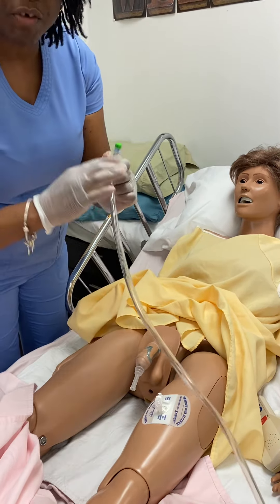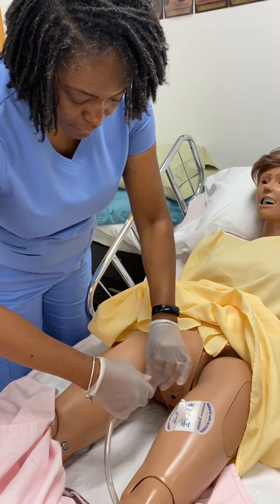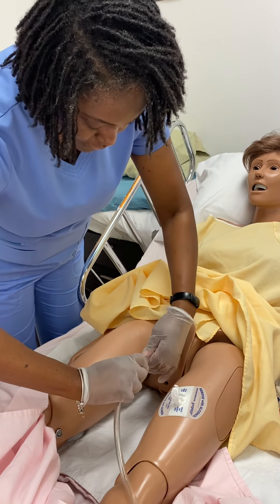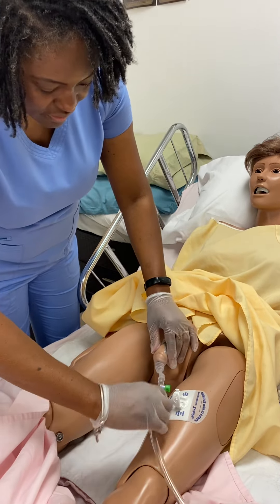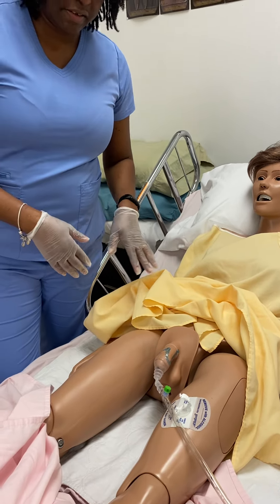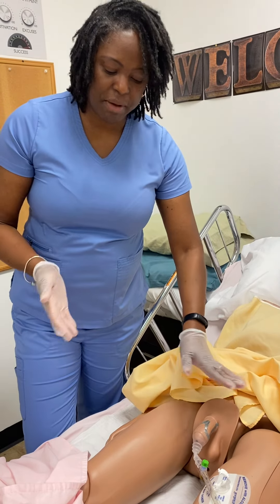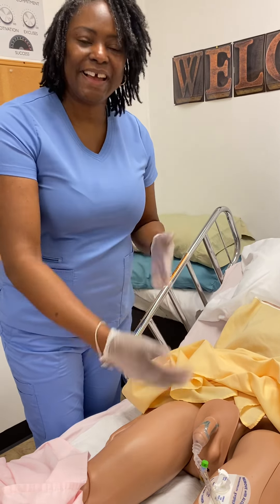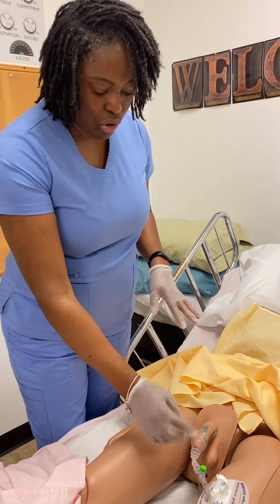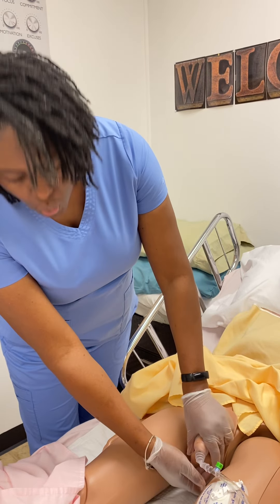Once we finish, the Foley catheter bag that's connected to the bed simply connects there. In some facilities, nurse aides, we don't need an order for that, but if we need an order, make sure that we get it. Make sure we take these off every couple of days and clean the penis. Make sure we inspect to ensure that there's no breakdown under the shaft of the penis or under the scrotum.